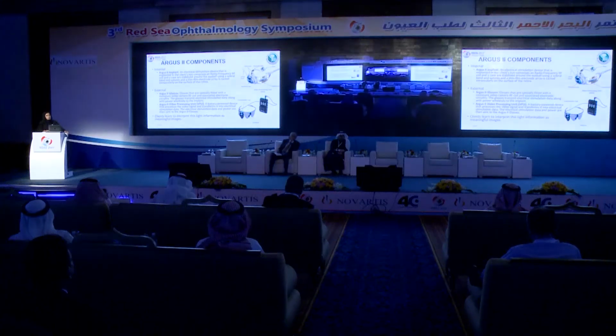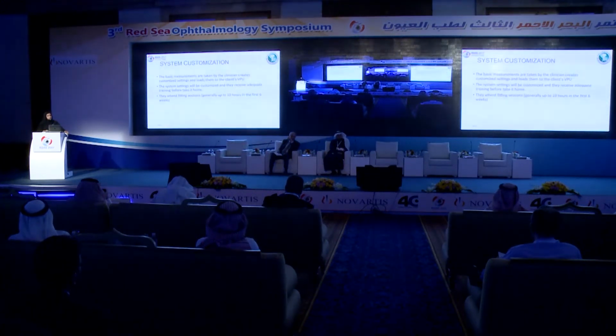Then there is the video processing unit, a battery-powered device that processes the video signal and transforms it into electrical stimulation data, which is then sent to the Argus II glasses. The patient learns to interpret this light information as meaningful images.